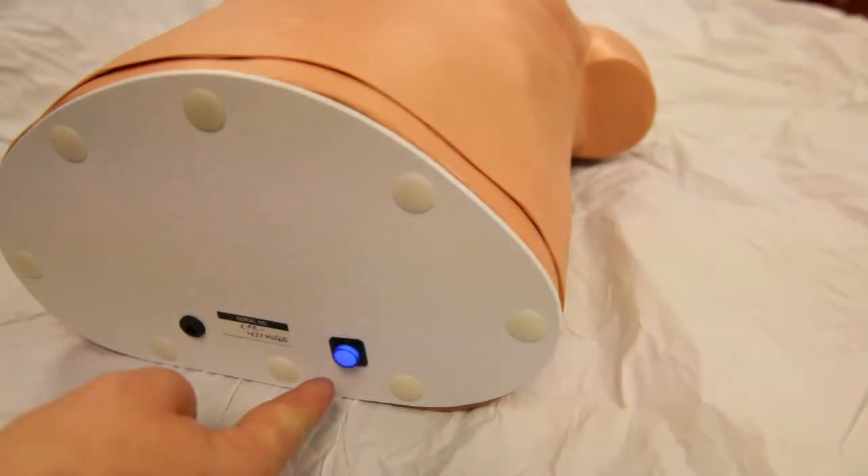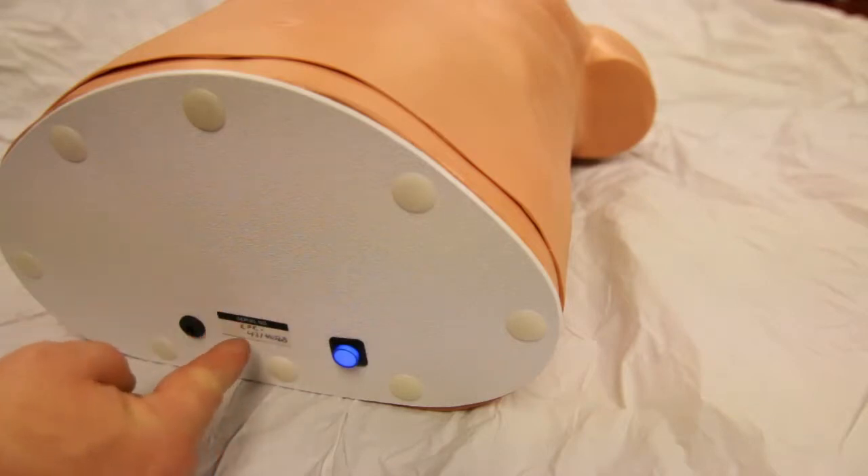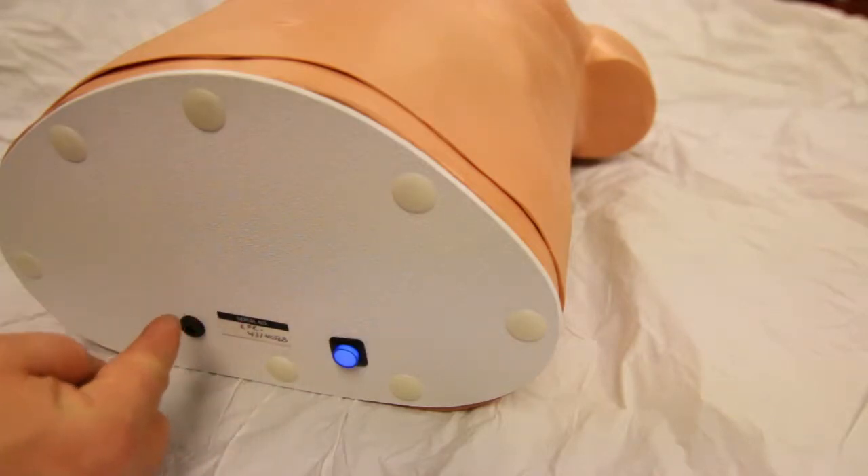On the end, you have the power switch, unit serial number, and AC power plug.